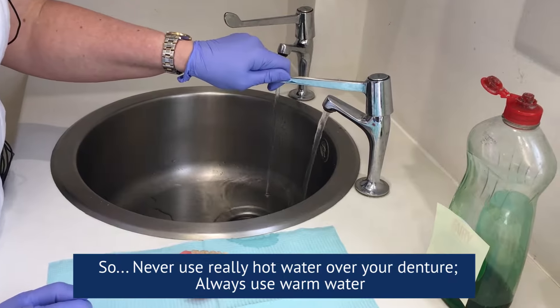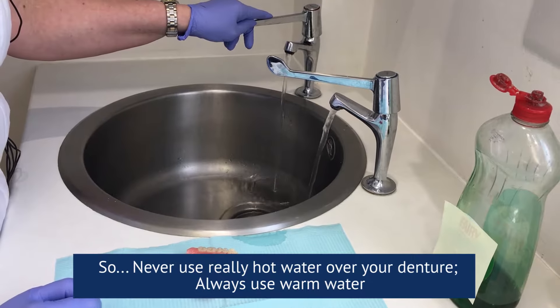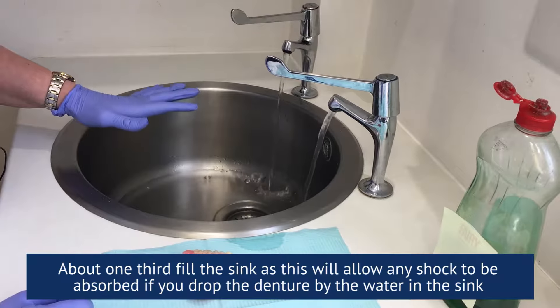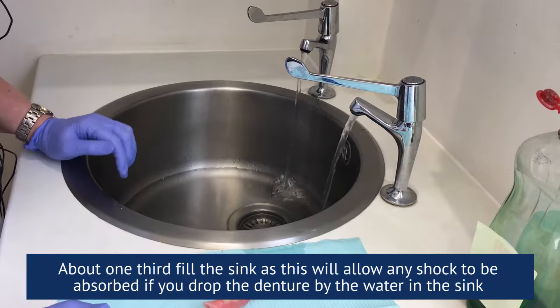Never use really hot water on your denture — always use warm water. About one third fill the sink, because this will allow any shock to be absorbed if you drop the denture by the water that's in the sink.